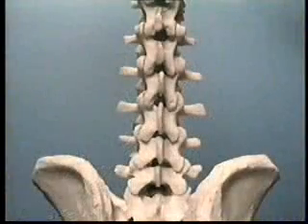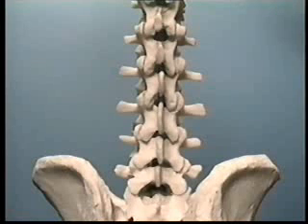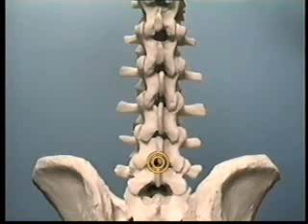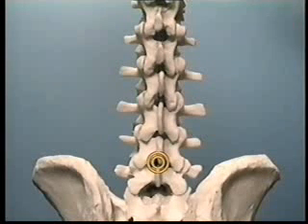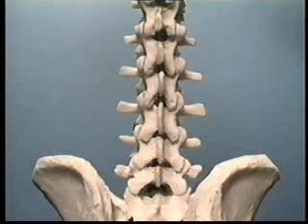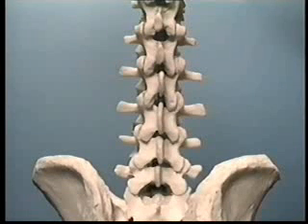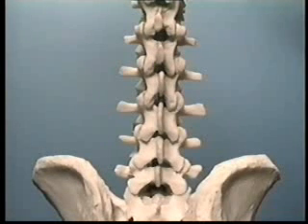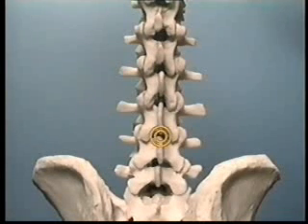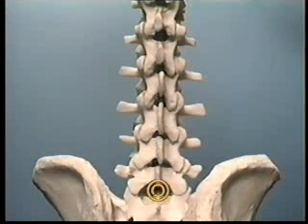For a lumbar puncture, the interspace of choice is L4-L5. The spinal cord has terminated by this level, and the interspace height allows easy access to the cistern. Other possibilities for an LP are at L3-L4 and L5-S1.